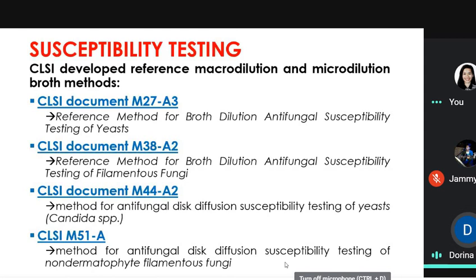So, I have never done antifungal susceptibility testing, in all honesty. I've been trying to read, and this is really my dilemma. I asked Sir Edwin, how do I do it? Usually you spread the microorganism, our bacterial culture, on the plate, and make a good lawn with no spacing, which is why we call it a lawn.